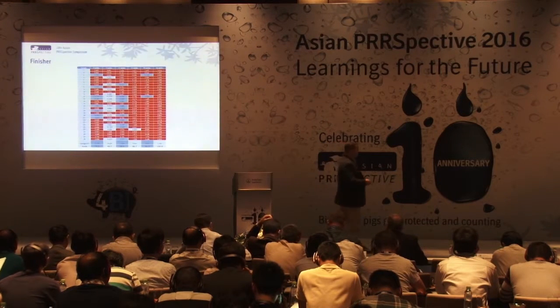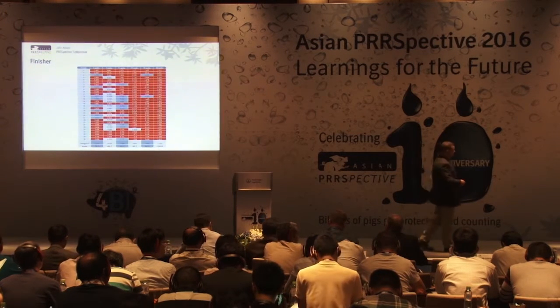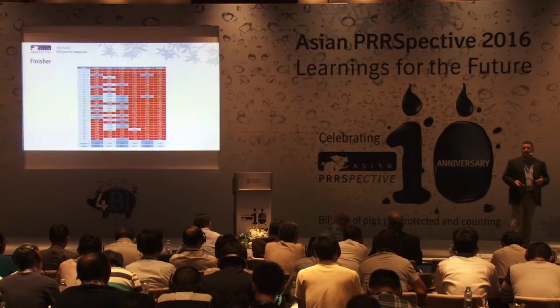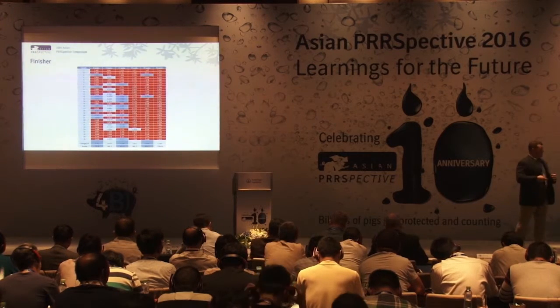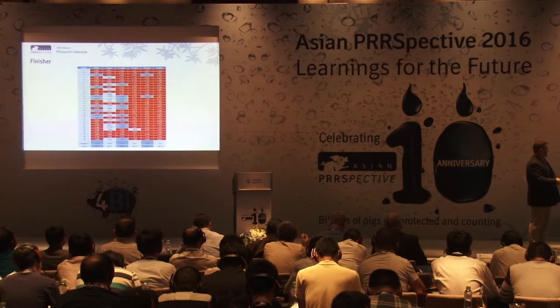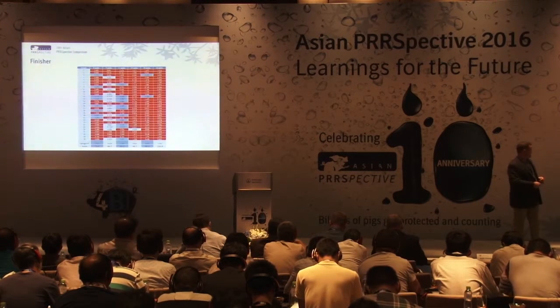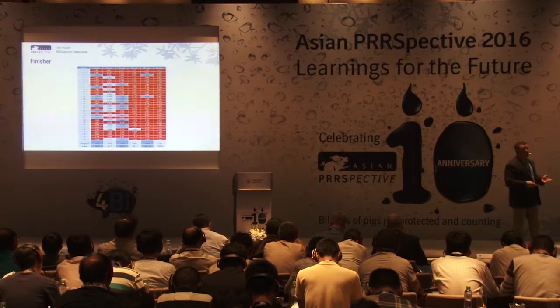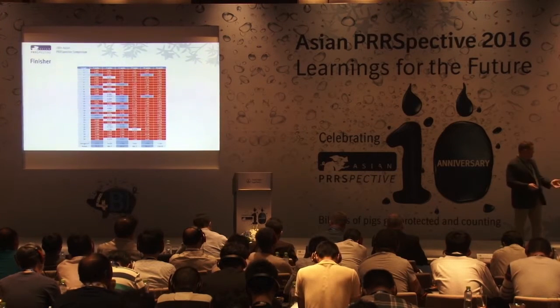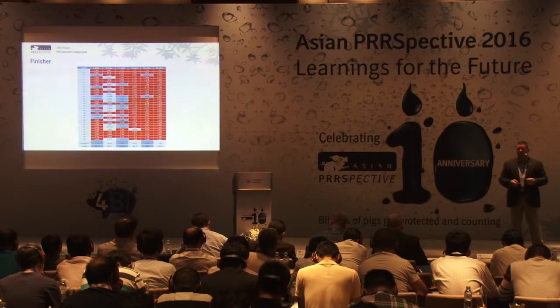We see here that at 3 weeks of age, so right at weaning, we have an average S to P ratio of about a 0.7, and 73% of our pigs are ELISA positive. If we continue to follow these pigs, at 7 weeks of age, we see that we've dropped from 73% ELISA positive down to less than 50% ELISA positive, and our average S to P ratio has dropped from a 0.7 down to a 0.45. So, very, very nice decrease in the average S to P ratio, and a pretty hefty decrease in the number of positive animals by ELISA.